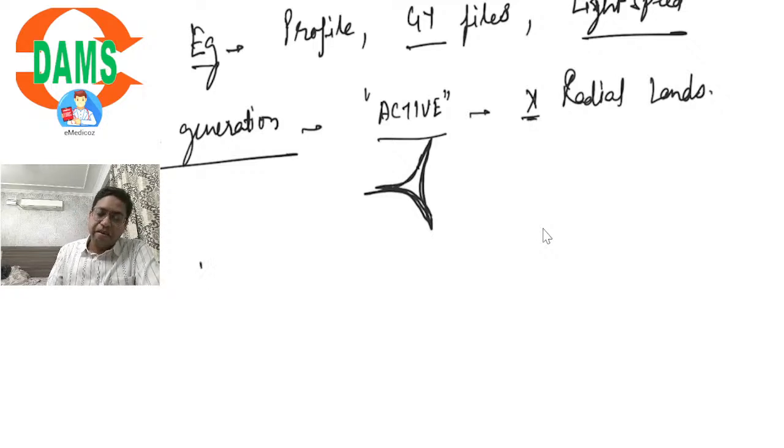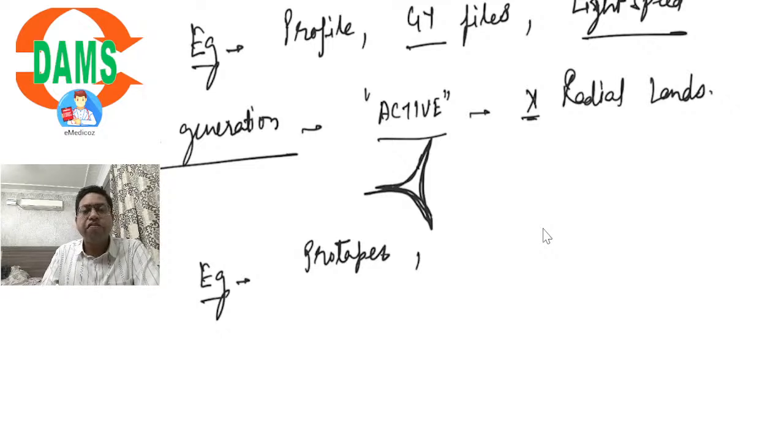Examples of instruments which come under this category are ProTaper. All of you must have heard the term ProTaper, one of the most common and significant instruments, most dominant instruments through which rotary endodontics started.